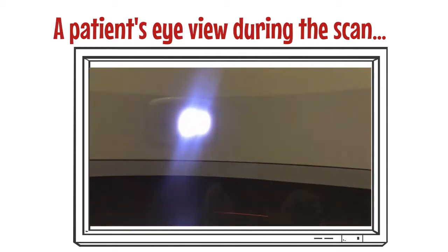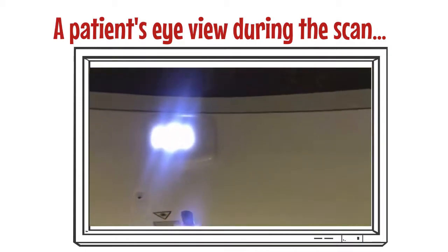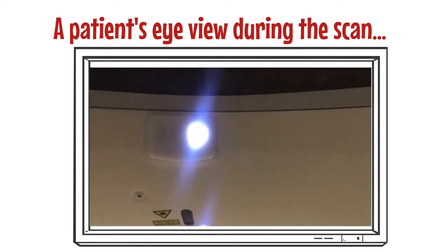Take a breath in and hold it. You may breathe normally.